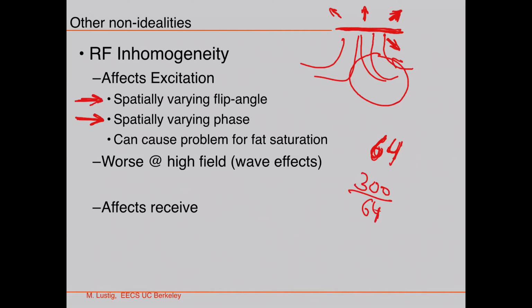So how much is it? 4.7 meters. That's the wavelength, so it will be pretty uniform across the body.